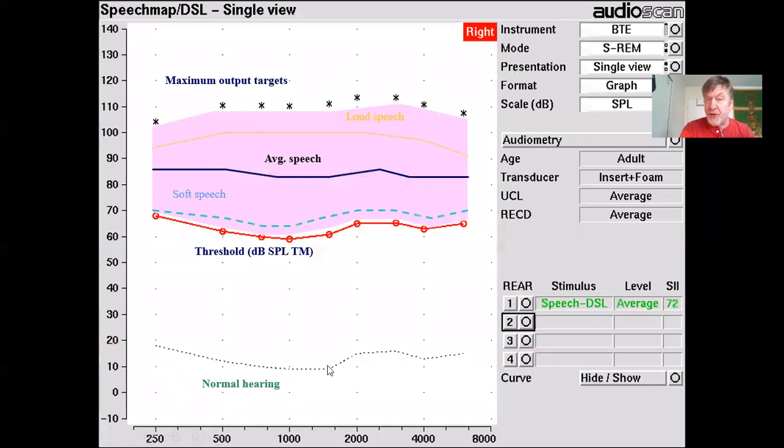Minimal audible pressure on the bottom. Here's a hearing loss. So if you can think of this minimal audible pressure or 0 dBHL as a flat line, and then you see this curve above it that matches the shape of the curve at the bottom, you really then know that what they're plotting here is actually a flat 50 dB hearing loss, don't you?